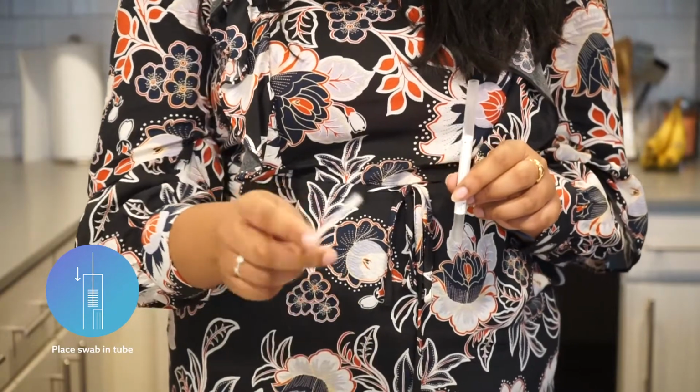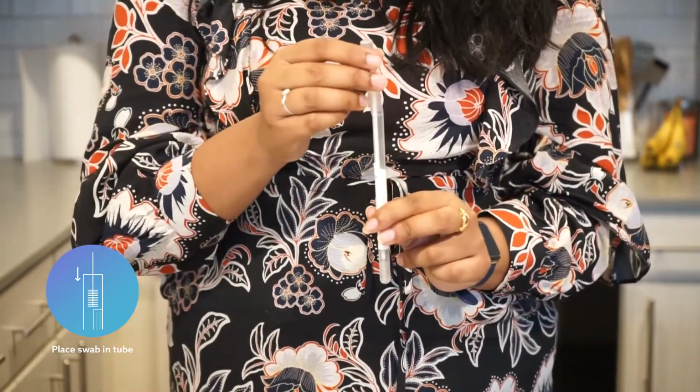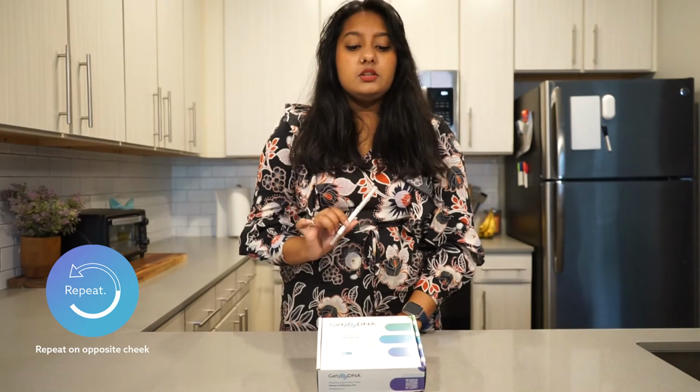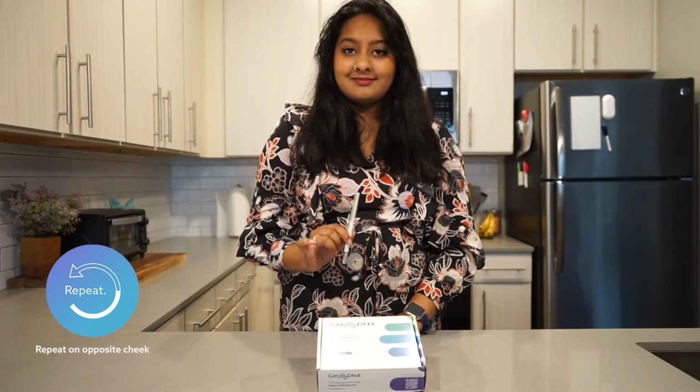Using the tube your swab came in, place your swab bristle side down back into the tube and securely close the cap. Using the unopened swab, repeat the process on the opposite cheek. Do not reuse the previous swab and do not swab the cheek that you just swabbed.